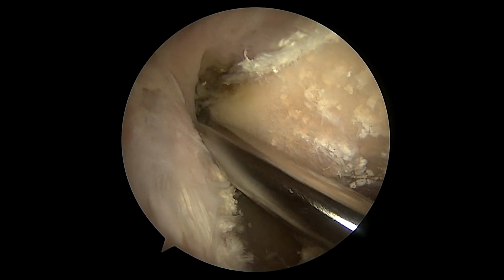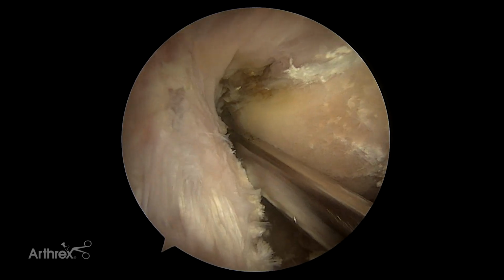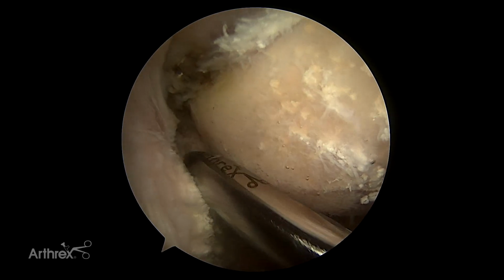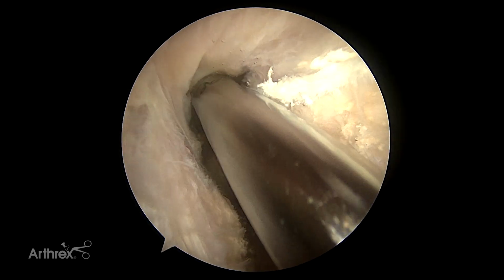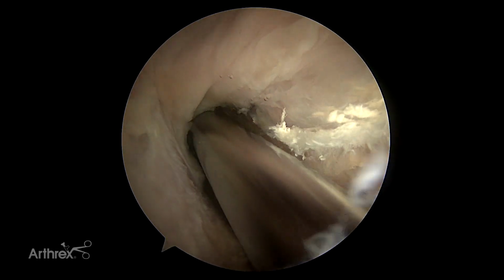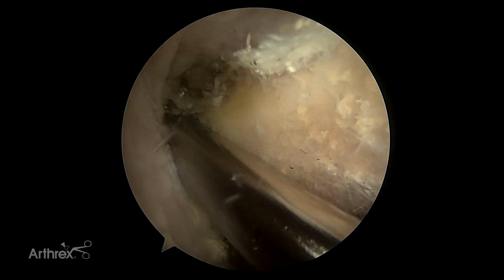All right, so here we are in our right knee. Here's the ACL. We're on the medial border, developing a view of the medial eminence, which is often maybe osteophytic or prominent. We're trying to eventually do a meniscal transplant in the appropriate patient or perhaps a posterior horn root tear repair. So we're going to talk about using the PoweRasp to finish off in a controlled fashion the medial wallplasty right along here where this shaver is right now, and then also an eminence plasty.